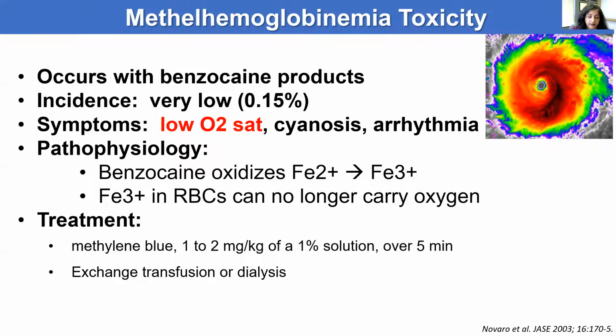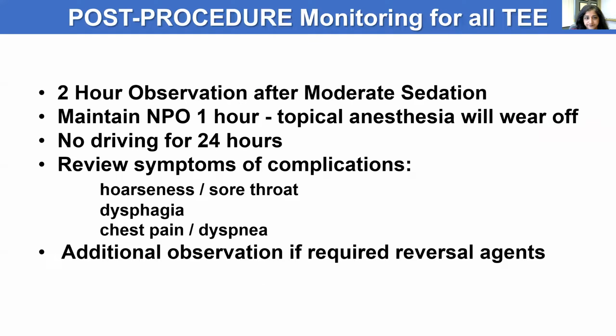It's important to recognize it if you're using what's sort of called hurricane spray or other benzocaine products. And equally important is to monitor the patient after the TEE. So it's a 2-hour observation period for moderate sedation. You generally maintain NPO status for an hour to let the topical anesthesia wear off. No driving for 24 hours. And before we release patients, all symptoms and potential complications are reviewed.